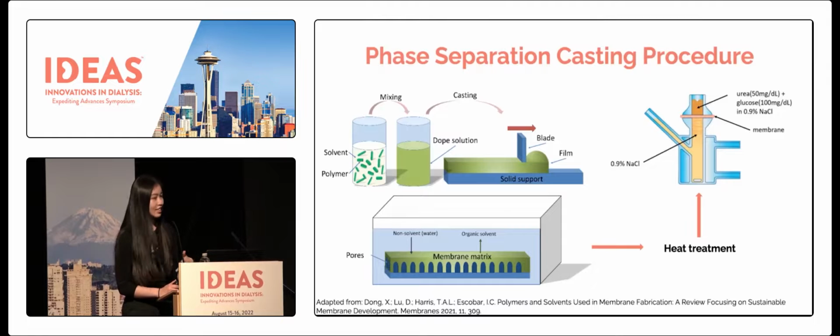After being cast, the solid support with the cast membrane is dropped into a non-solvent bath, which in this case is actually water. And then a non-solvent and solvent exchange happens, which generates a membrane matrix that is porous and which will enable the selectivity of the membrane.